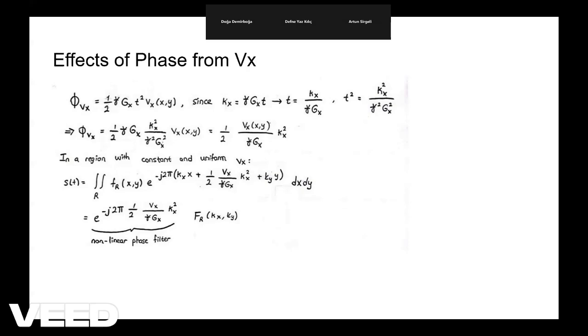Since the different frequencies are shifted different amounts, the total structure of the image will be dispersed and spread out or smeared. Luckily for us, most natural images have their frequency components concentrated in near and low frequencies. So the relative shift experienced by each frequency component is similar, but yet the small differences cause the smear effect.